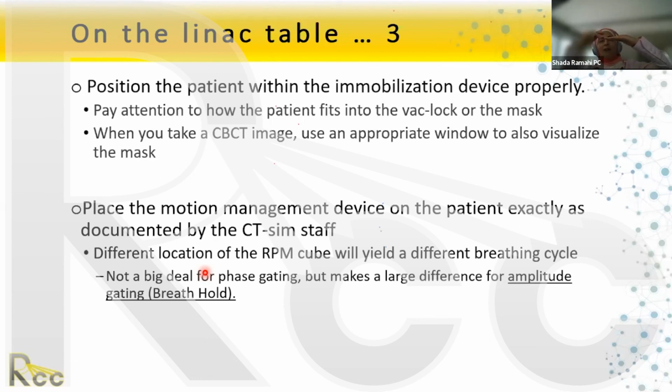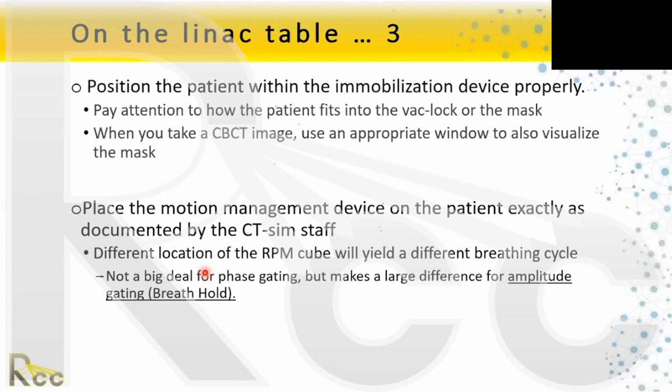So I would have what we call the pitch. The patient is aligned well, it's no one's fault. The CT sim therapists did their job right, the linac therapists did their job right, everything is fine, but it's the sagging. And actually we see it as physicists when you do monthly QA, you see the table sagging. How do we see it sagging? We see the lasers not aligned, and some people might think the laser is not aligned, no, actually the table is sagging. So you need the 6 degree couch to correct for this pitch if you're doing it. So ExacTrac, whether ExacTrac is enough for SRS?